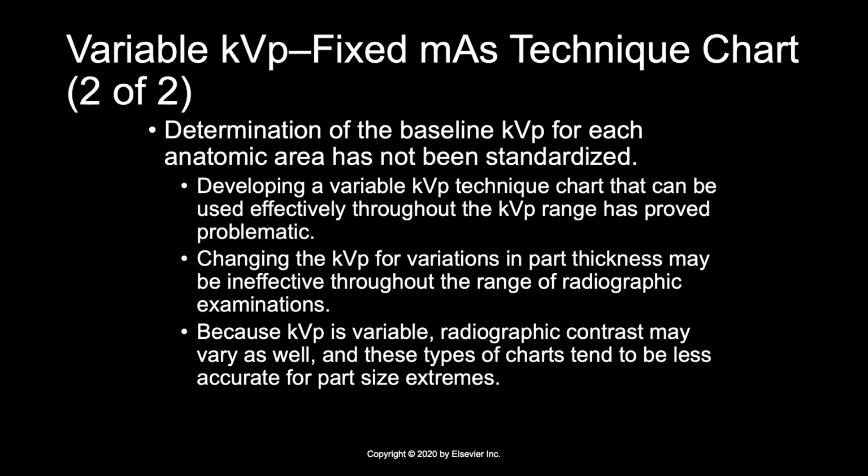So again, for the average patient, these technique charts seem to work. But if you have a patient that is any larger than average, then it becomes problematic. And the exposure techniques are not what we need them to be to make the diagnostic image.